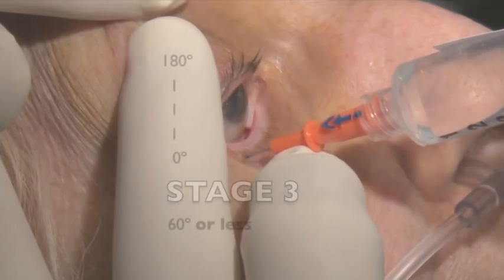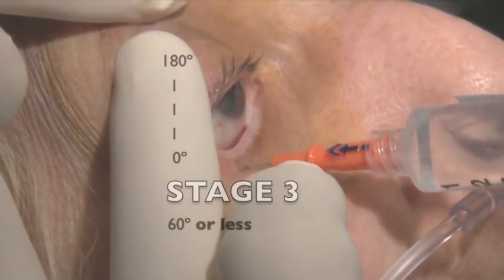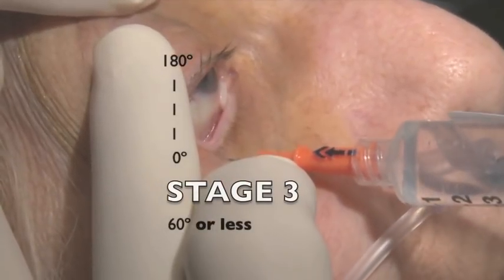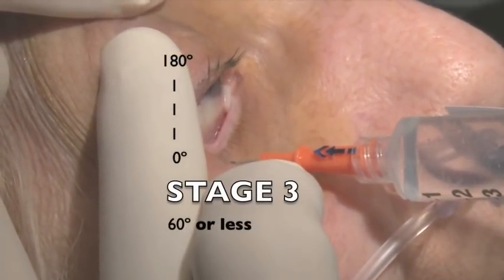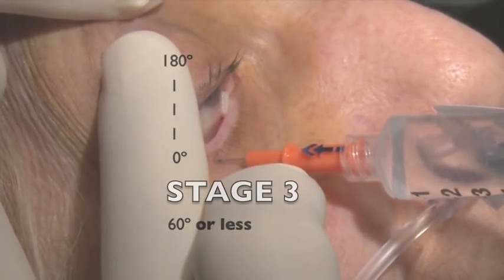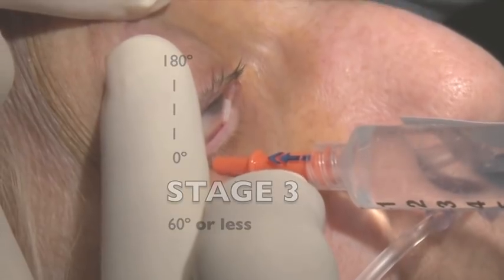Stage 3: rotate the needle tip cephalad until the shaft of the needle rests on the infraorbital rim, then slowly advance the needle tip into the intraconal space.